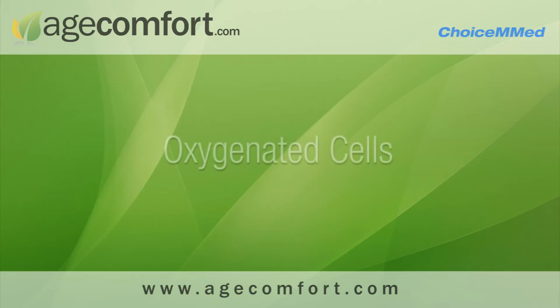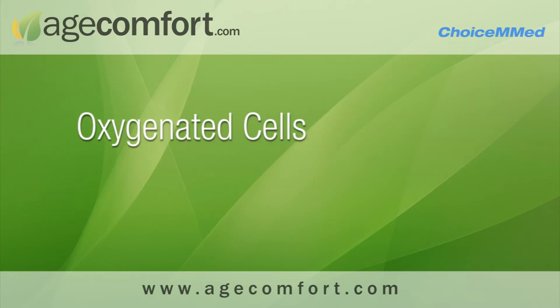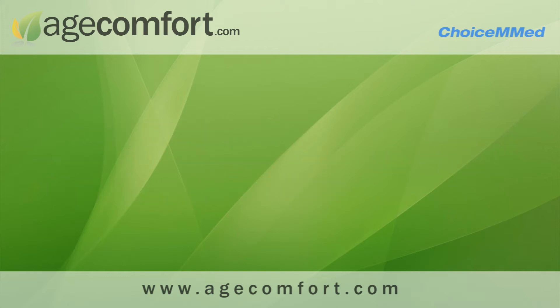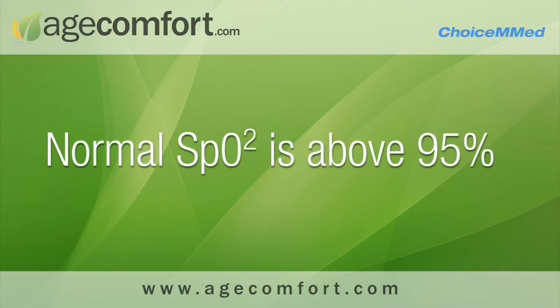The pulse oximeter obtains the ratio of oxygenated cells over deoxygenated cells to give you the SpO2 percentage. A normal SpO2 is typically above 95%. However, certain patients may have lower SpO2 depending on their condition.